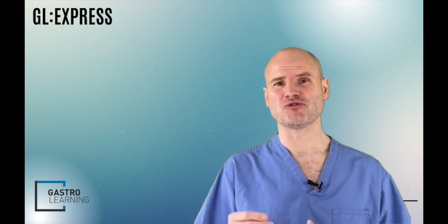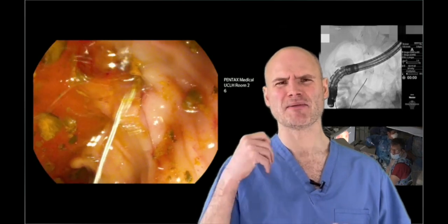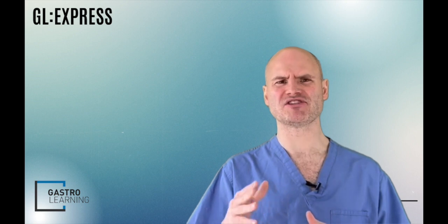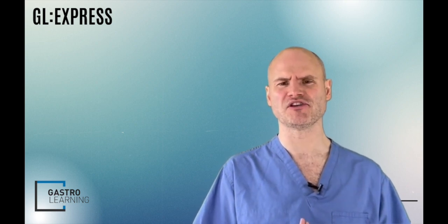In this study, for the metal stent group, the minimal stricture distance to the biliary confluence had to be approximately 2 centimeters, and the body of the stent resided completely within the bile duct, with the extraction string coming through the papilla into the duodenum. 6 months after this stent was placed, the patient was brought back for an ERCP to remove the stent. In the multiple plastic stent group, 1 or more 10 French plastic stents were placed across the stricture, with further procedures performed every 6 to 12 weeks, where the stents were removed, the stricture was dilated using a balloon, and then an increasing number of plastic stents were inserted.